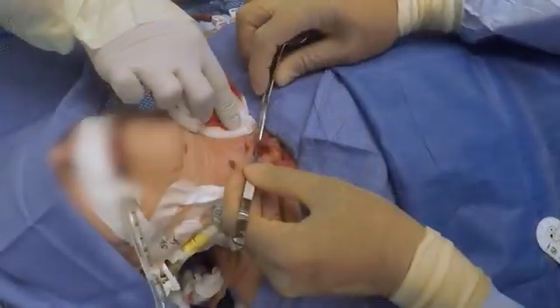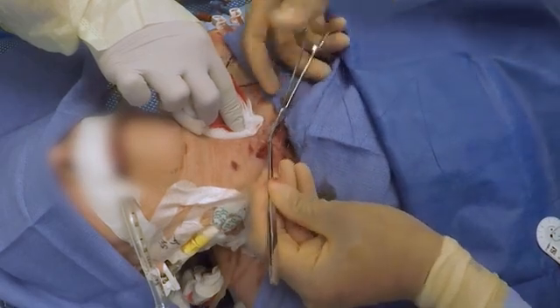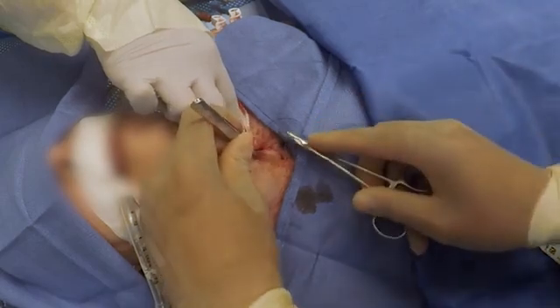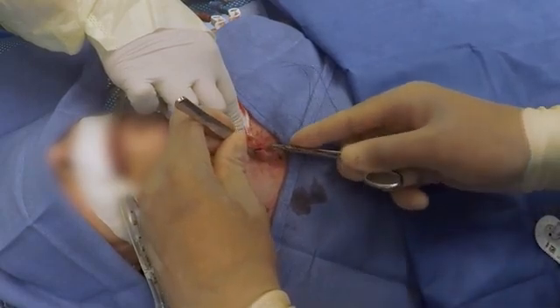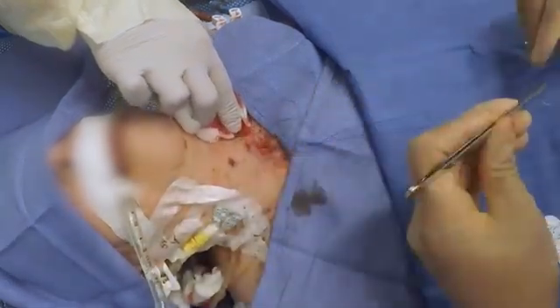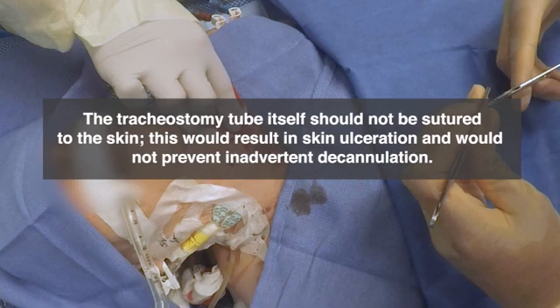In patients who require therapeutic anticoagulation or in whom there is any risk of bleeding, it may be advisable to place a purse-string suture around the tracheostomy incision with the use of a 2-0 prolene suture. The purse-string suture is placed but not tied during this step; it will be tied for additional hemostatic control once the tracheostomy tube has been inserted. The suture is generally removed on the second postoperative day if there is no evidence of bleeding. The tracheostomy tube itself should not be sutured in, as suturing results in skin ulceration and does not prevent inadvertent decannulation.